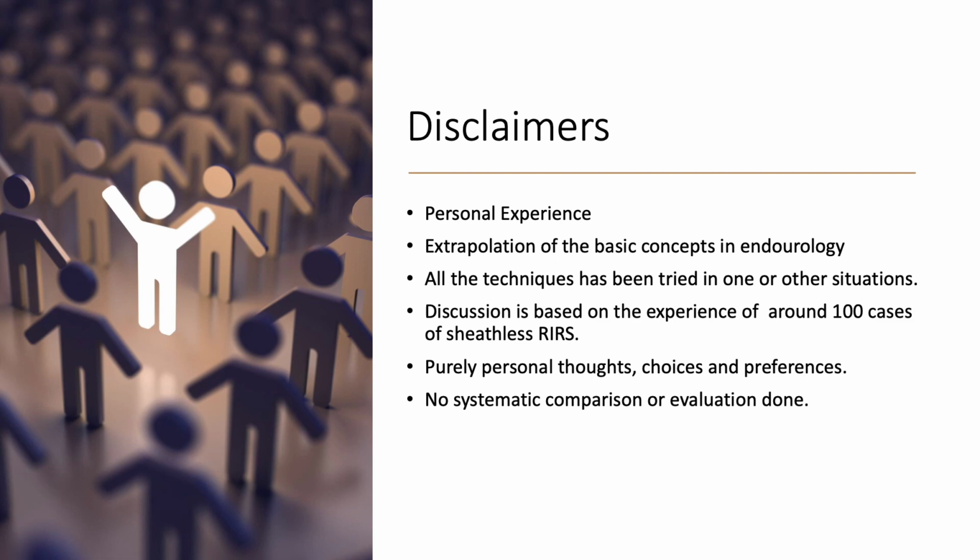I have a few disclaimers to make at the end. These are from my personal experience of around 100 cases, extrapolating basic concepts of endourology in sheathless RIRS. All the techniques were used on one or many occasions, but no systematic comparison or evaluation was done. These are purely my personal thoughts, choices, and preferences.